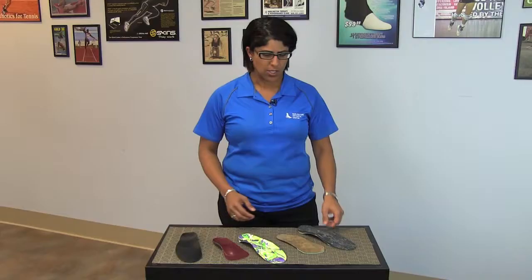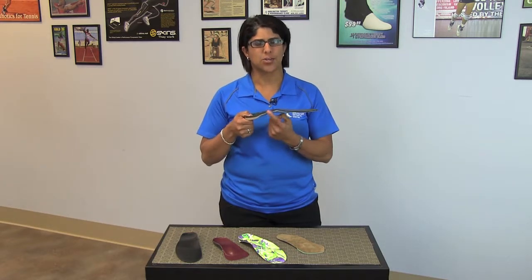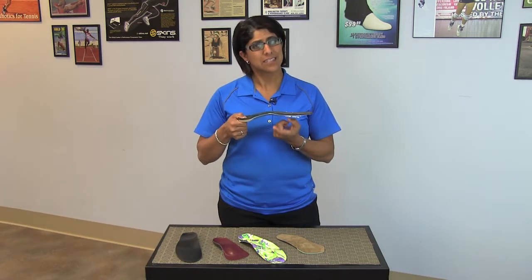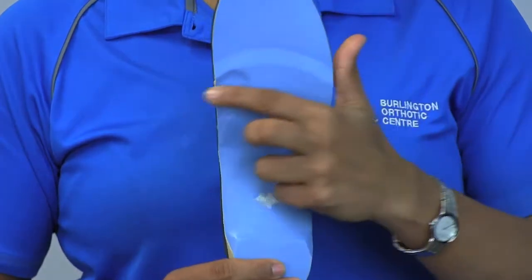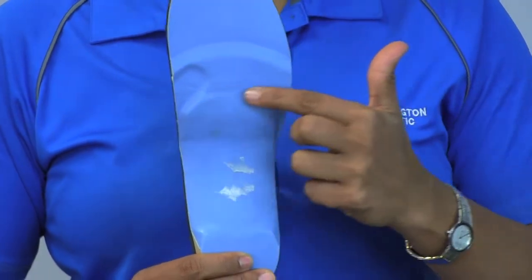What should an orthotic feel like? We get many people in our clinics every day that say it felt a little uncomfortable in the beginning. That's completely normal. Remember, you're not used to having something push up against your arch. The orthotic is supposed to feel like it's pushing up against your arch. Sometimes you feel the transition between the end of the orthotic and the end of the cushioning.